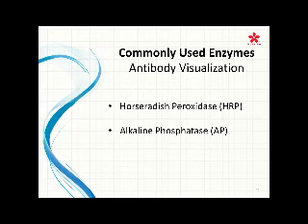But just to give you a breakdown of how this works. Whenever you have your tissue section and you cut it, you're going to deparaffinize your slide. You're going to perform epitope retrieval, whether it's being done manually or on your instrument, either by heat or enzyme or by both heat and enzyme. And then your detection system is applied. So when we're loading our slides onto our immunohistochemistry instruments, keep in mind that these are the steps that are happening, and understanding what those components are of your automated immunohistochemistry system and how they're actually working to react with the antibodies.